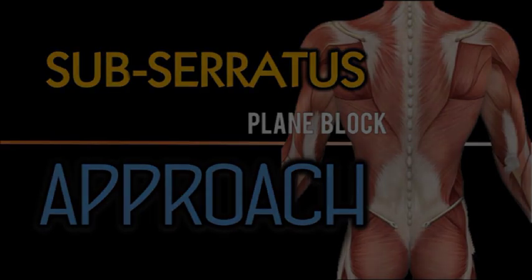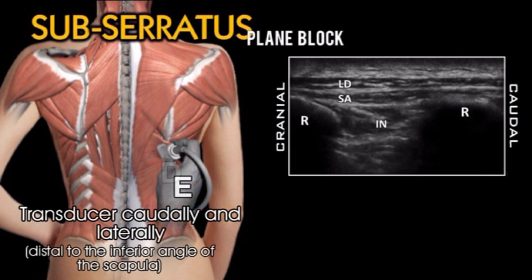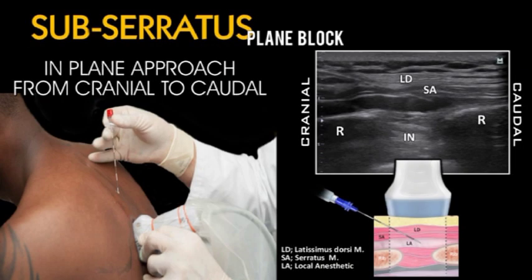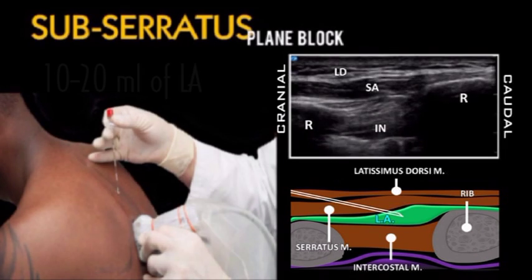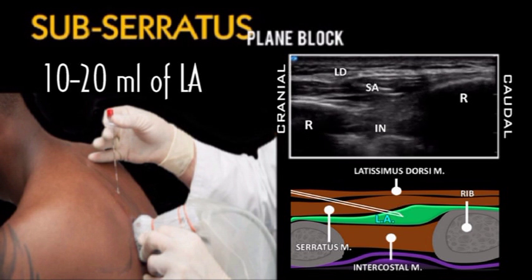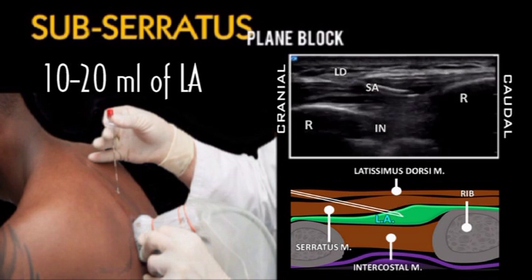To identify the sub-serratus plane, move the transducer caudally and laterally to the inferior angle of the scapula. Identify the latissimus dorsi, serratus anterior, and intercostal muscles between the ribs. Then advance the needle in-plane directed caudally and laterally. Inject 10 to 20 ml of local anesthetic in the tissue plane between the serratus anterior and the external intercostal muscle and ribs.